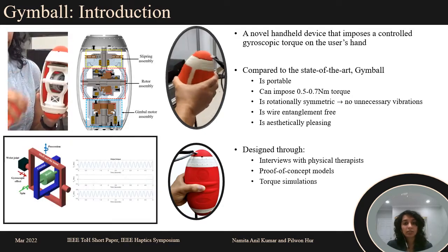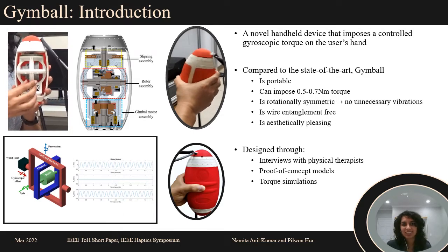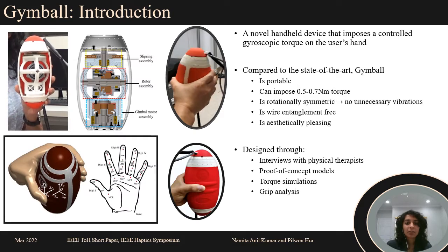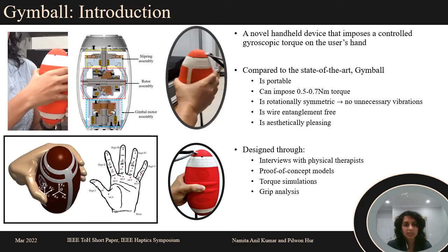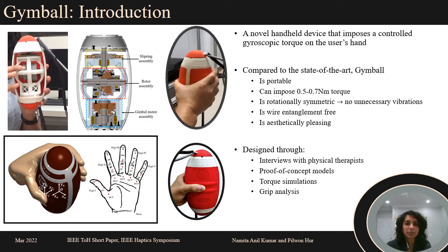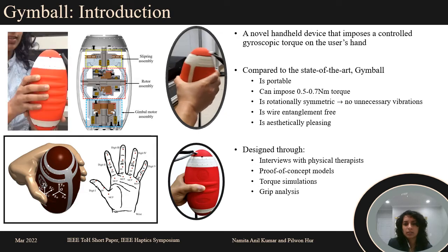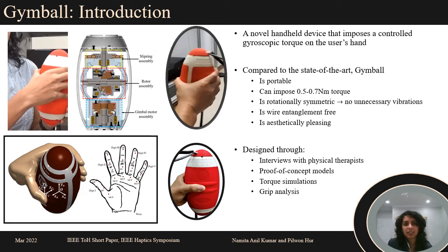Torque simulations in Simscape helped select motor specs and rotor inertia. Finally, grip analysis helped design grooves along the enclosure to allow for a comfortable grip. The grip analysis involved a non-linear optimization and a grasp map.